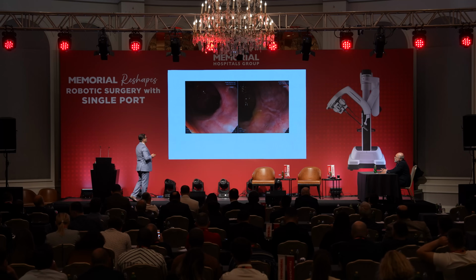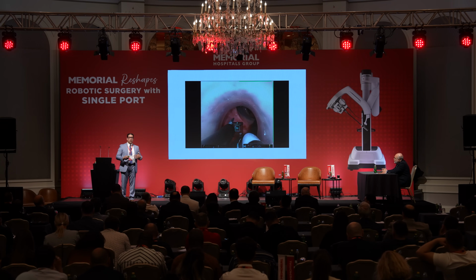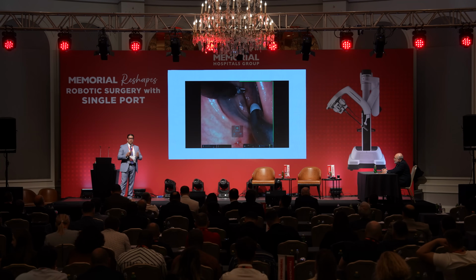Now the SP for transanal is such a great tool. So far, if you ask me what is the only indication that I can suggest or recommend, I will tell you definitely transanal. And we are still trying to find our sweet spot for segmental resection in the colon.